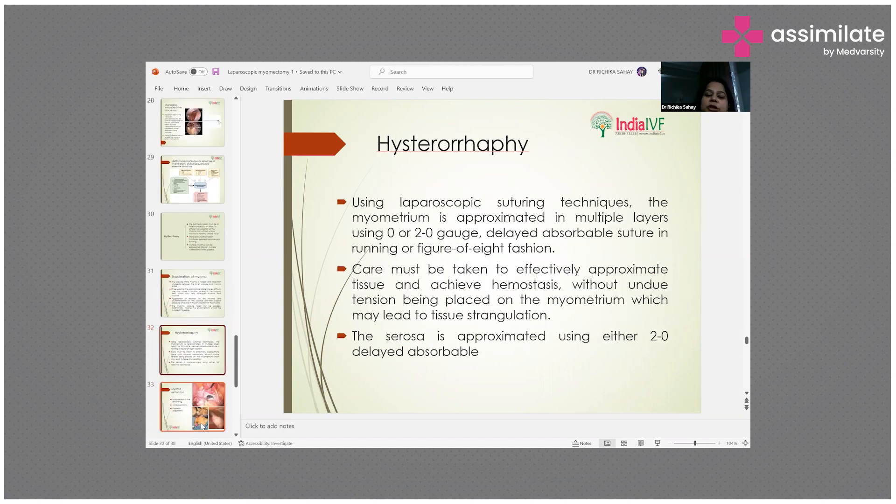Using laparoscopic suturing techniques, the myometrium is approximated in multiple layers using 0 or 2-0 gauge delayed absorbable suture in running or figure-of-8 fashion. Care must be taken to effectively approximate tissue and achieve hemostasis without undue tension being placed on the myometrium, which may lead to tissue strangulation.